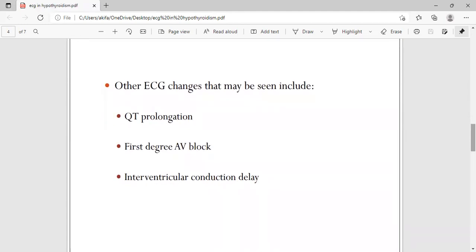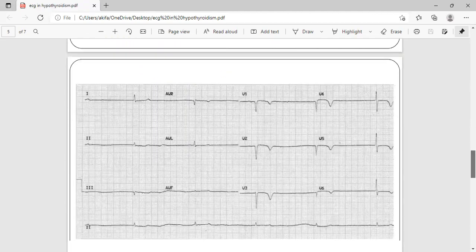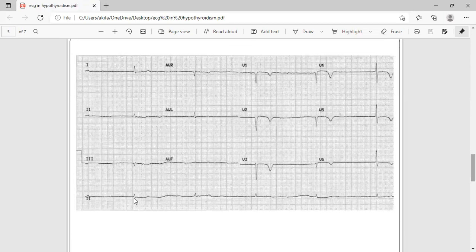Other ECG changes in hypothyroidism: because thyroid hormones are essential for normal body function, when they are low, everything slows down. ECG changes will all be prolonged — there will be QT prolongation, first-degree AV block, and interventricular conduction delay. So everything will be prolonged in patients with hypothyroidism.